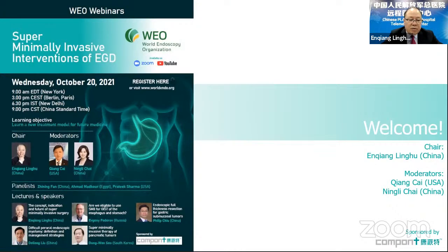SIMS is believed to achieve a therapeutic effect similar to that of the surgical treatment without damaging organ structure and function. That is, cure disease, recover as before. It will not affect the normal survival time and the post-operative quality of life of patients.